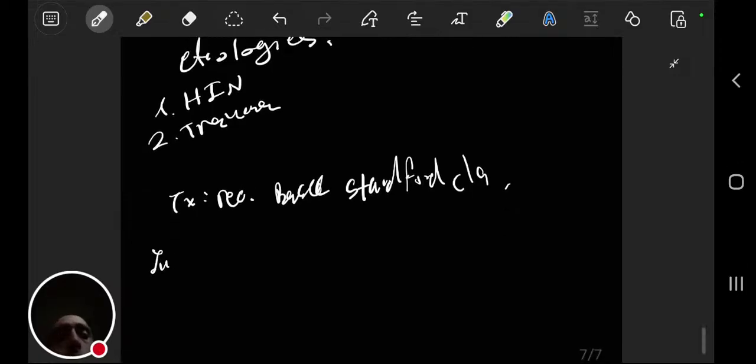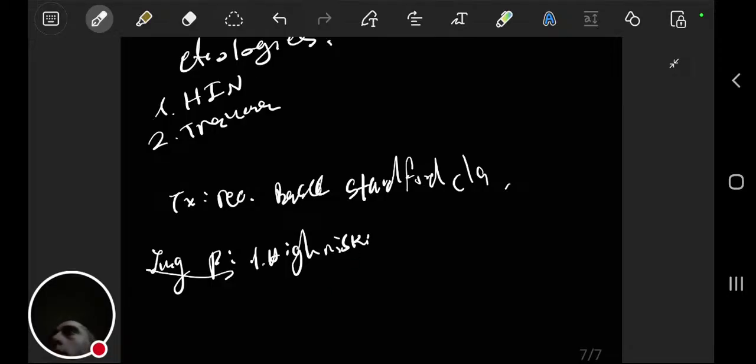When I'm talking about high risk, I'm talking about an unenhanced phase, specifically to evaluate the intramural hematoma.